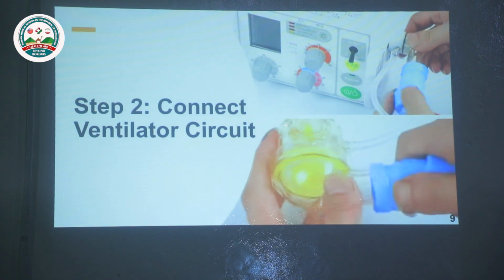And step two is to connect the other side. The other side is the breathing circuit. The blue line showing here is the inspiratory circuit, and connect it to this yellow adapter. This adapter has a one-way valve, and it can divert the gas, inhalation gas and exhalation gas. And the small bore connects to the pressure line, and this pressure line also connects to the yellow adapter over here to measure the pressure around the mouth of the patient and show it on the screen.